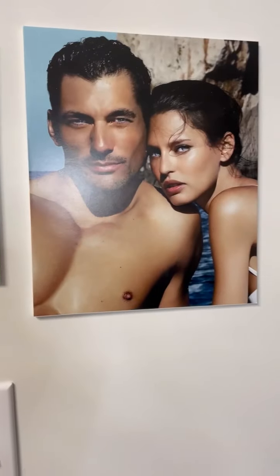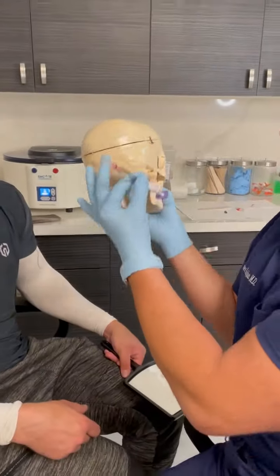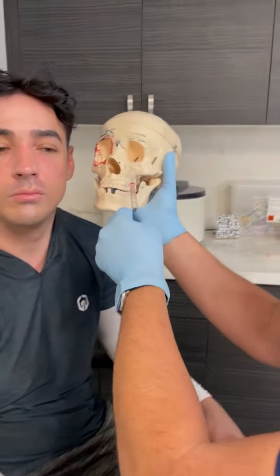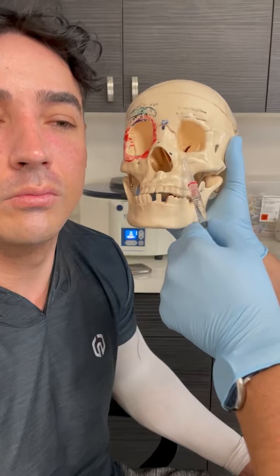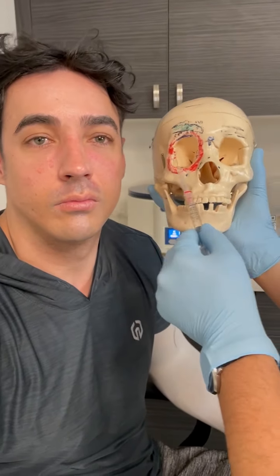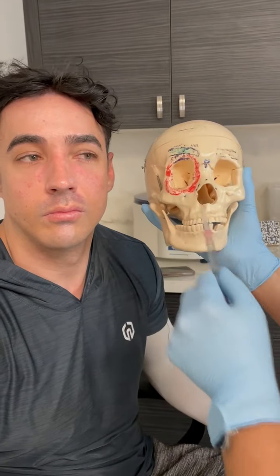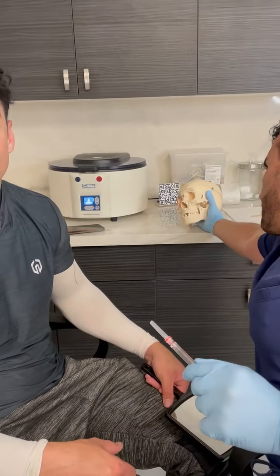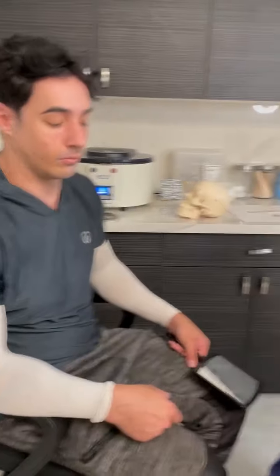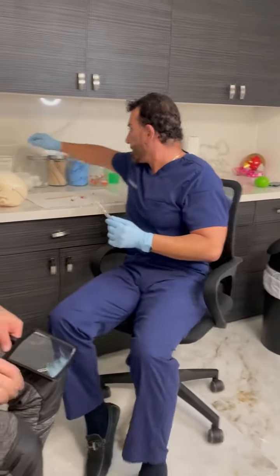It has to look like the natural zygomatic arch, which is here. If you see, the zygomatic arch has fullness medially, midline, and laterally. And so we're just recreating that. You can see the 3-point promontory on Herman, the model for our skull. So now we're gonna do the same thing on this side. Here we go. So I'm gonna get some gauze. His face has been cleaned.